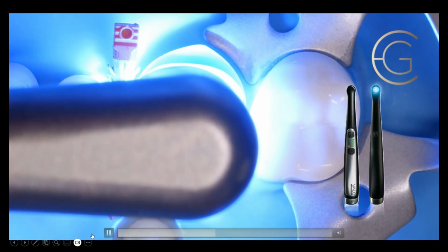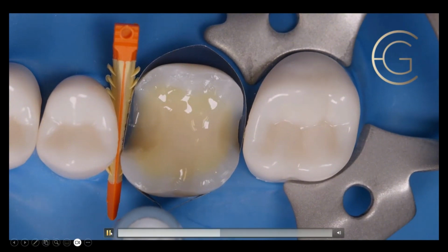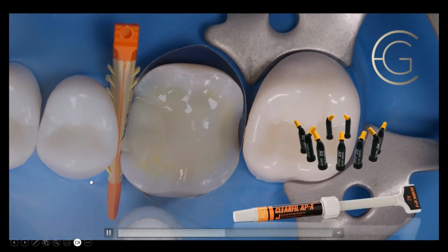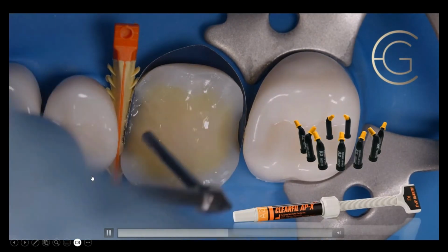So this is the same thing you would do for a direct. If you're doing a class 2, this is where you would put this layer down before you started layering your posterior composite in increments. I hope that makes sense. So now I'm going to fill in this void a little bit, and I do it in 1 millimeter increments. And again, I can build this up and go from there.